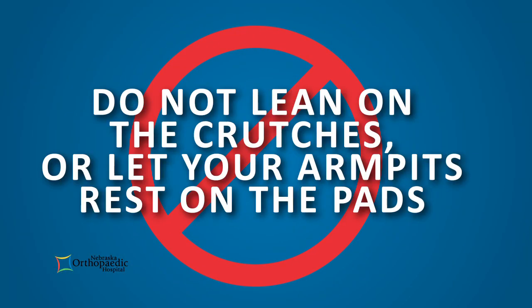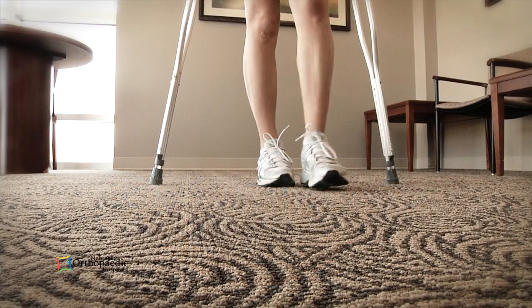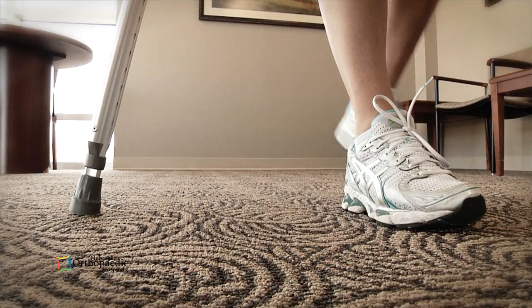Do not lean on the crutches or let your armpits rest on the pads, as this may cause numbness and loss of muscle strength. When walking with the crutches, keep a wide but comfortable base of support.